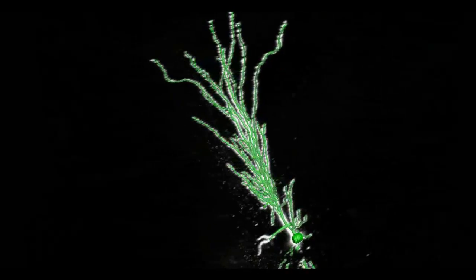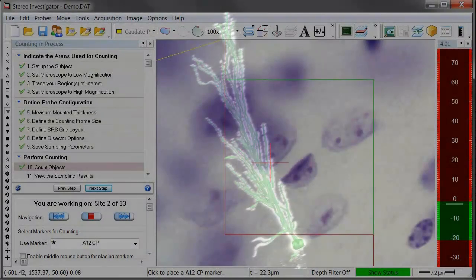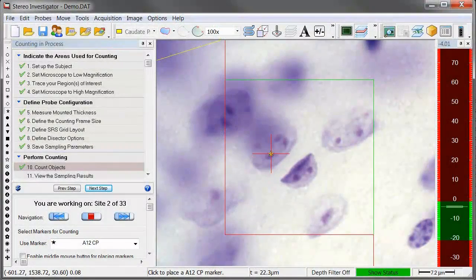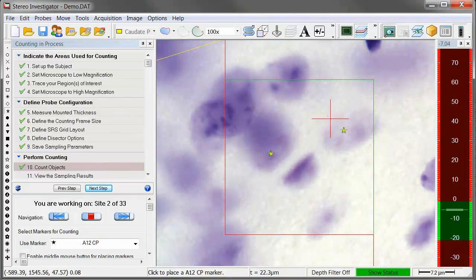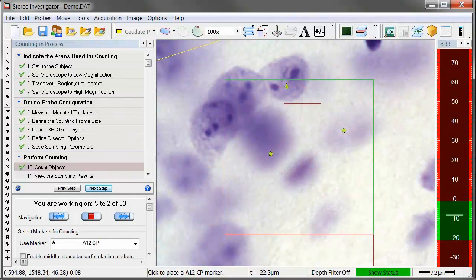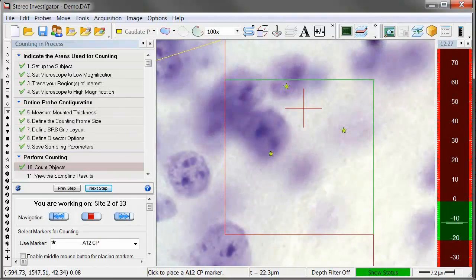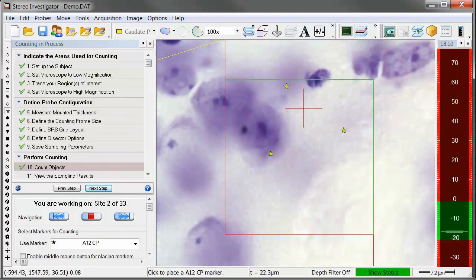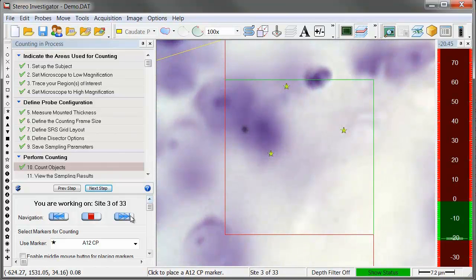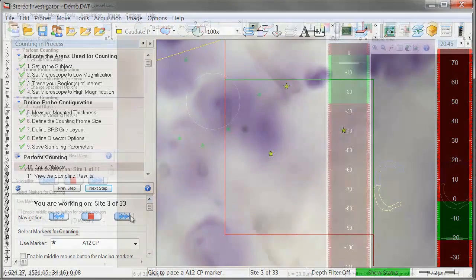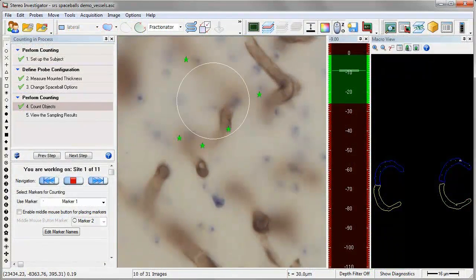Use Stereo Investigator with your whole slide image to quantify number, size, and regional volumes of biological structures. Virtual Tissue gives you the ability to run multiple probes with different parameters on the same region of interest using one image.